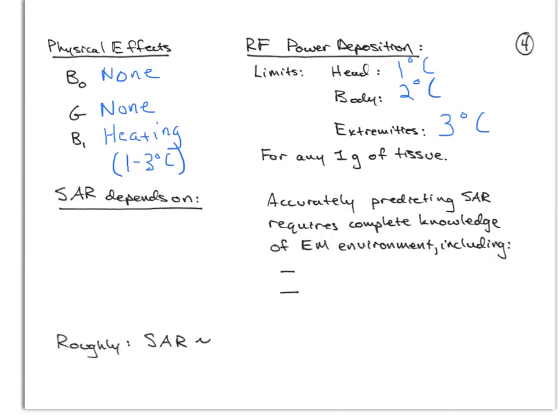And at the same time, you start heating up the body, and the body actually changes itself a little bit, right? It might start increasing blood flow to the region that's getting heated up so as to remove heat. So it really depends on a lot of factors, and it's very difficult to predict accurately, but it depends on vascularization.